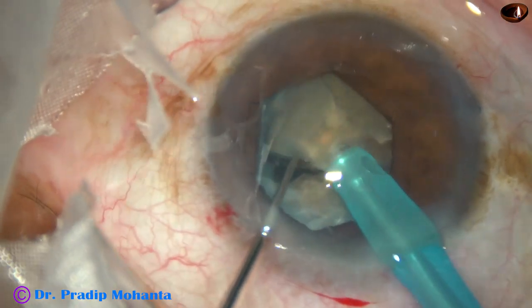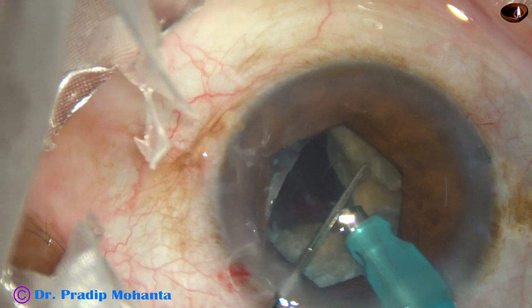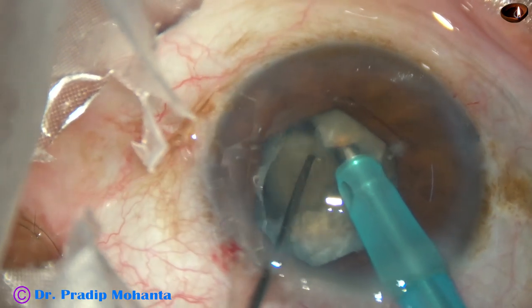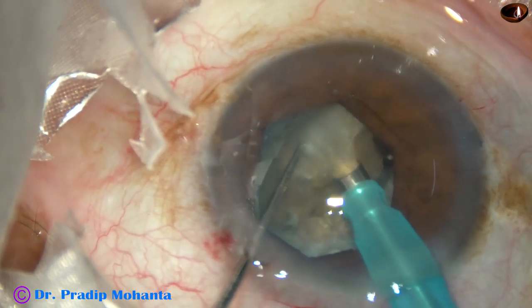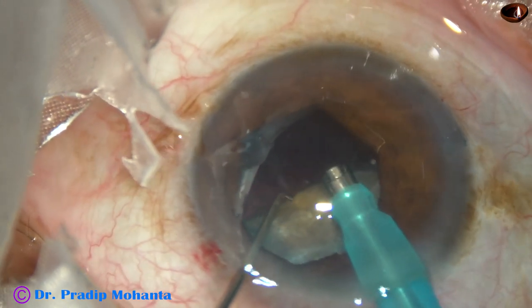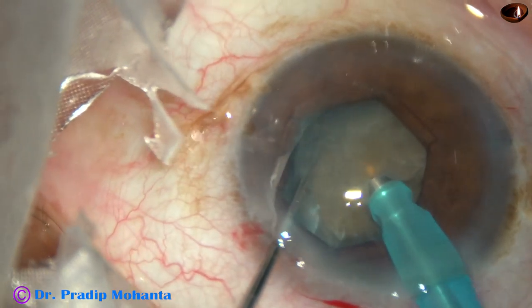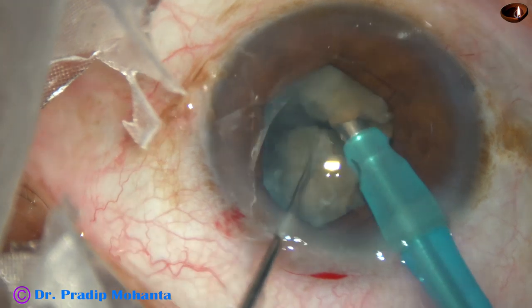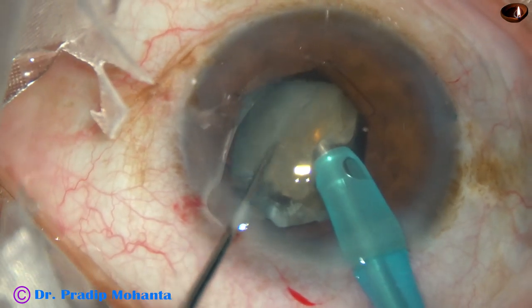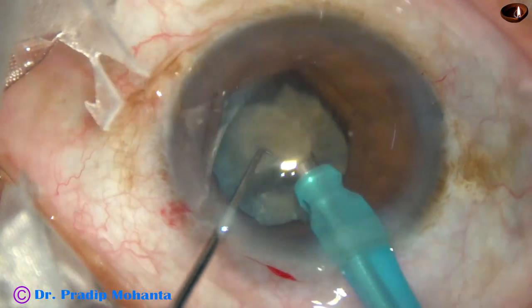I pick off the fragment on the right side, divide it into two pieces — so each hemi-nucleus has been practically divided into four small pieces, and they are emulsified and removed. The phaco power — ultrasonic energy used in this case is 75%. This is the Faros from Oertli, Switzerland. The other hemi-nucleus is also divided into four pieces, and each small nuclear piece is emulsified and removed.